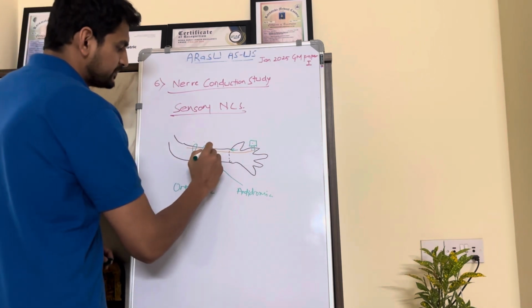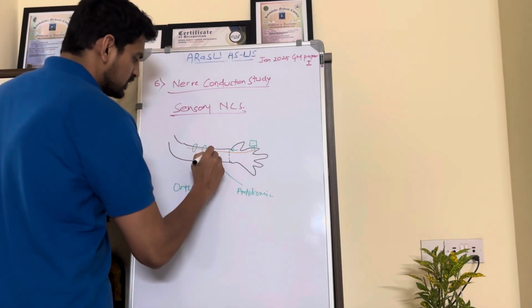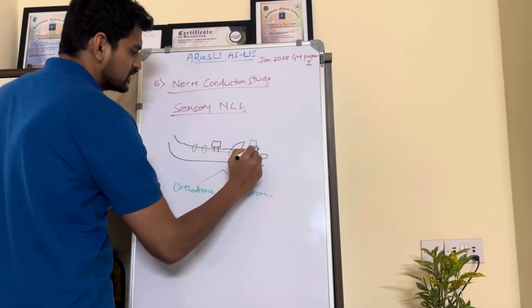Suppose we reverse it. For example, if we are considering stimulus here, and we are measuring the response distally. Suppose we place electrodes like this.